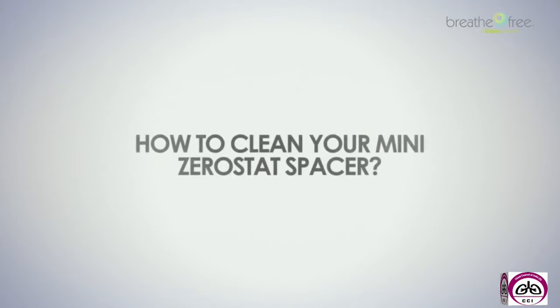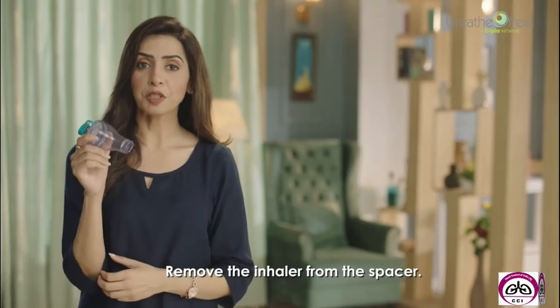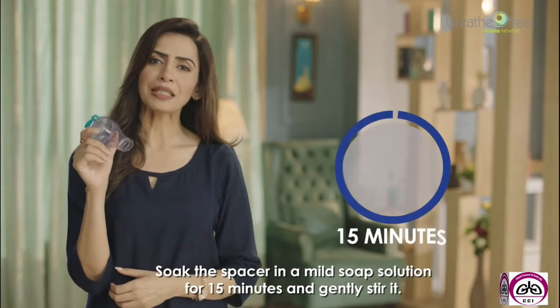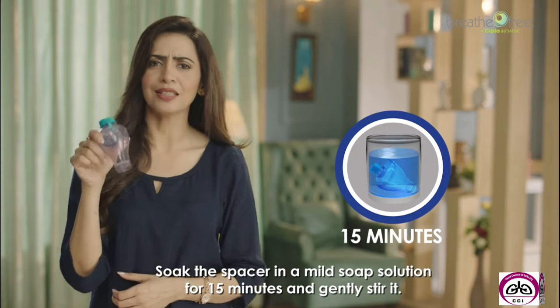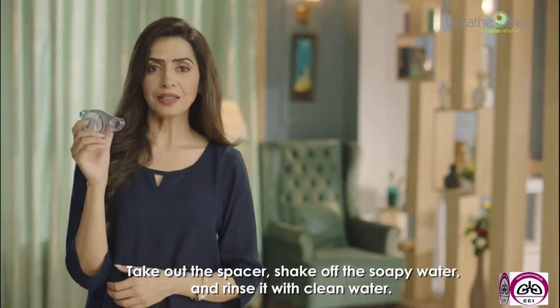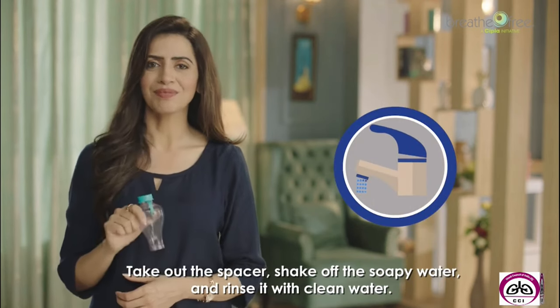Cleaning instructions and information. Remove the inhaler from the spacer. Soak the spacer in a mild soap solution for 15 minutes and gently stir it. Take out the spacer, shake off the soapy water and rinse it with clean water.